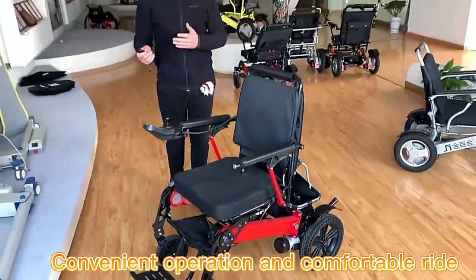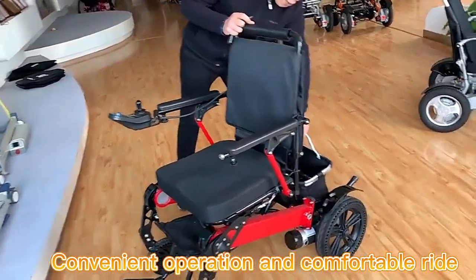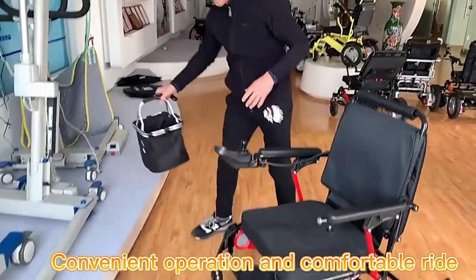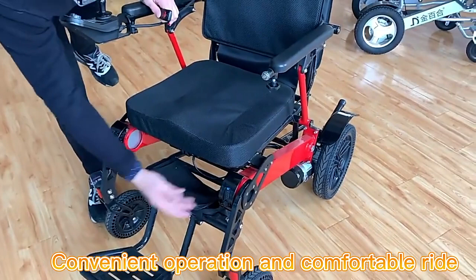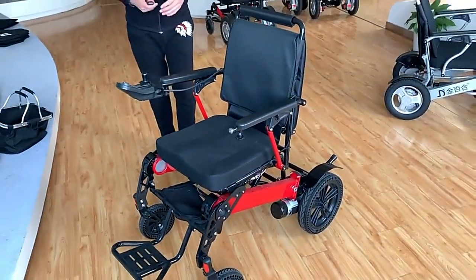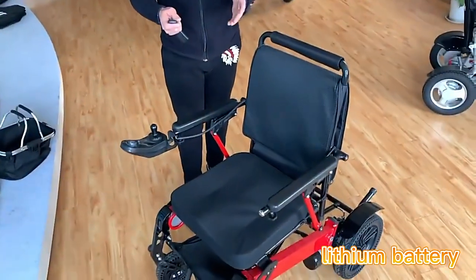Let me demonstrate to you how to remote fold and unfold this unit. Before we do that, we need to take the basket out on the back. This model has a special design that allows you to load more stuff, and also the back has more space that you can load in some material when you want to remote fold and unfold the unit.